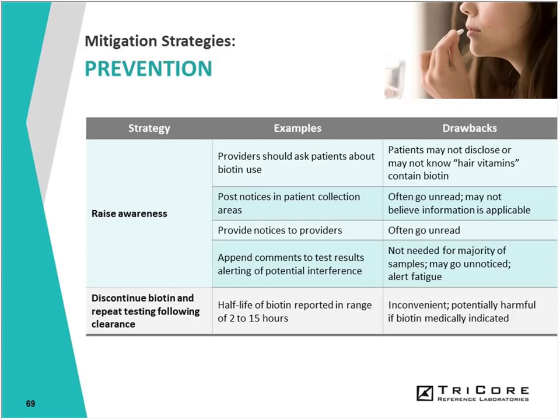Now, if patients are known to be taking biotin, they should be advised to discontinue its use prior to sample collection. The half-life of biotin in the blood is brief, and studies have reported half-lives that range between 2 to 15 hours.